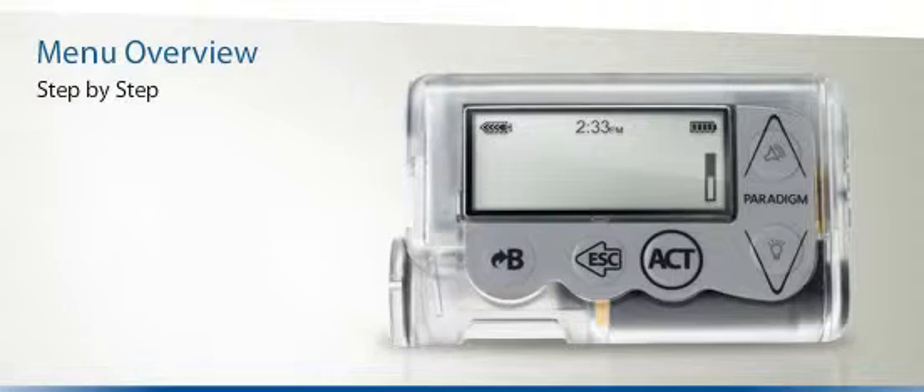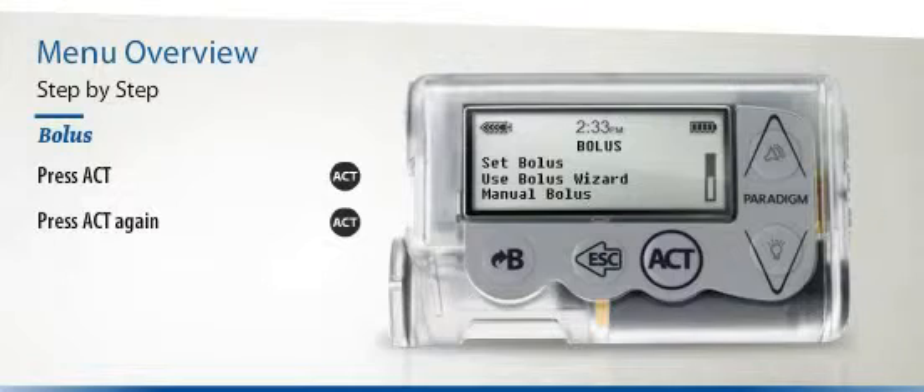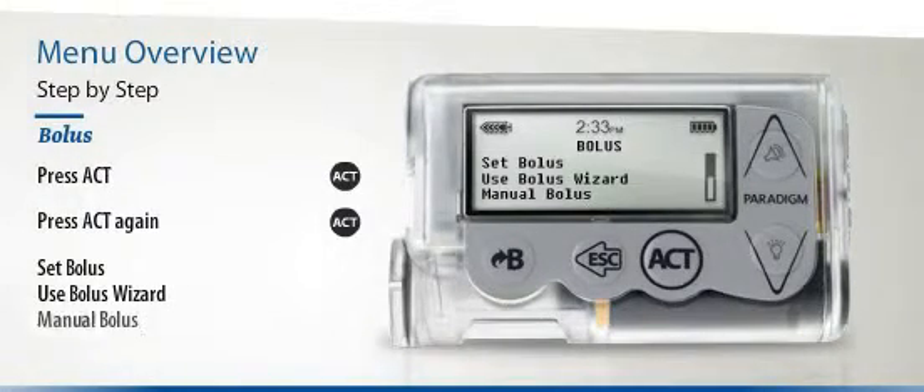But what if you are looking for the Bolus menu? Once again, begin by pressing the Act button once. The Bolus menu will already be highlighted, so press Act again. Items in the Bolus sub-menu will include Set Bolus, Use Bolus Wizard, Manual Bolus, and many more.